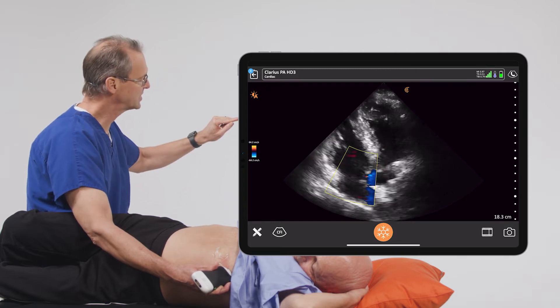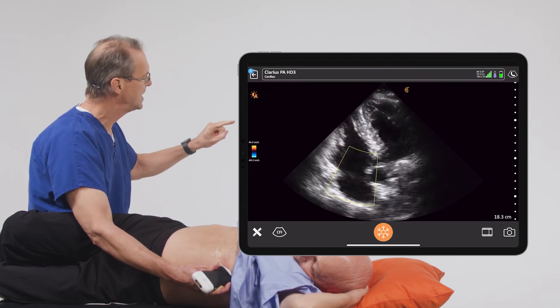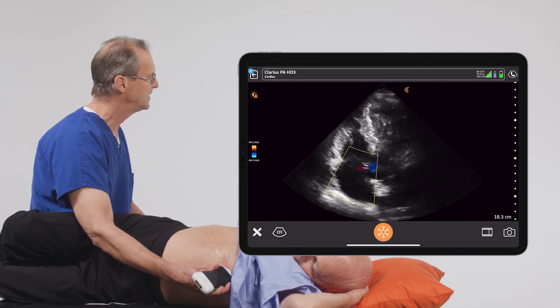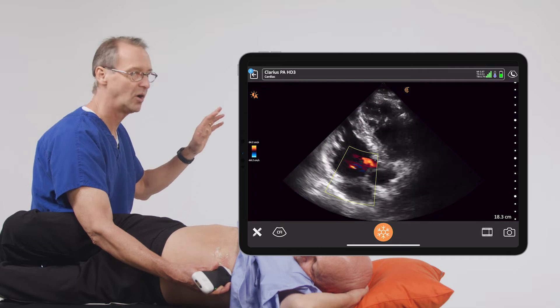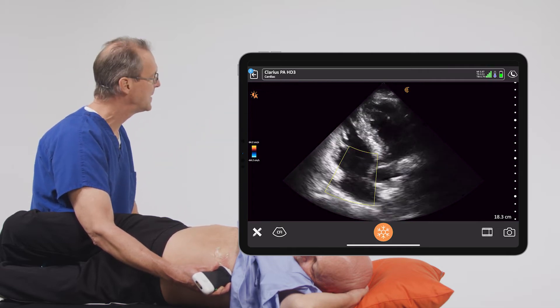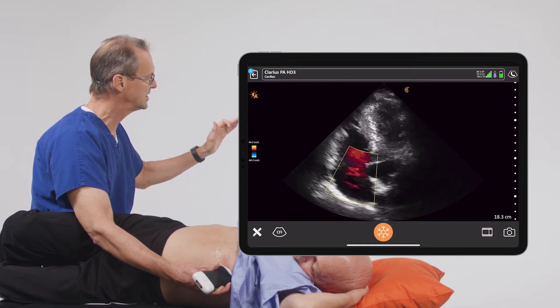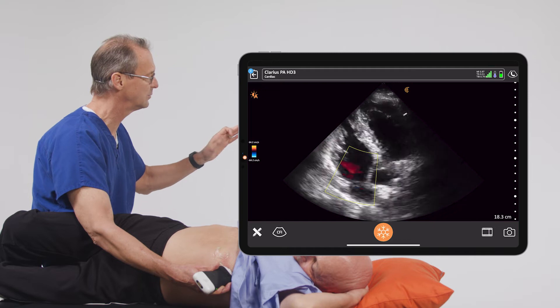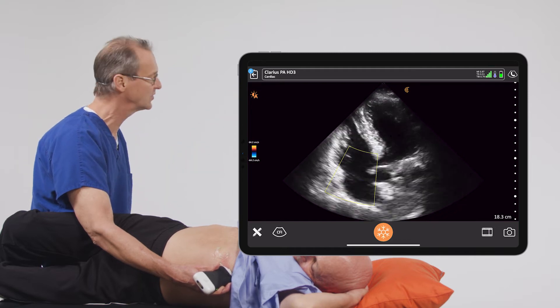We also see on the left side of the screen there's a color bar. At the top of the color bar, we see a red-yellow color, and this is the color given to all blood that is moving towards the transducer. And on the bottom of the color bar, we see it goes from dark blue to a light blue, and these are the colors given to blood that is moving away from the transducer.